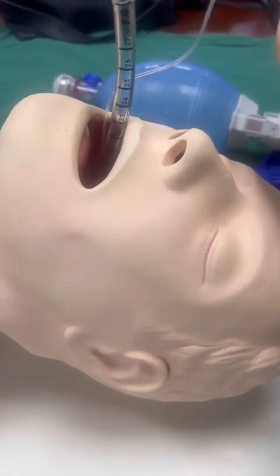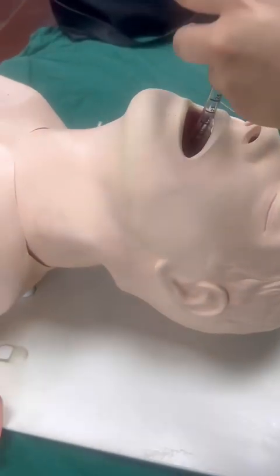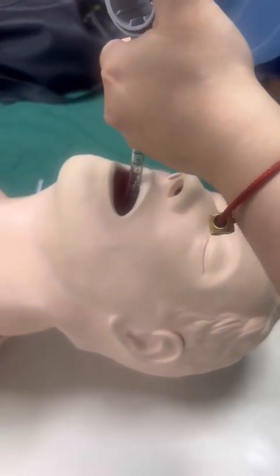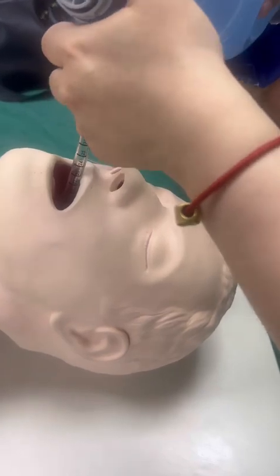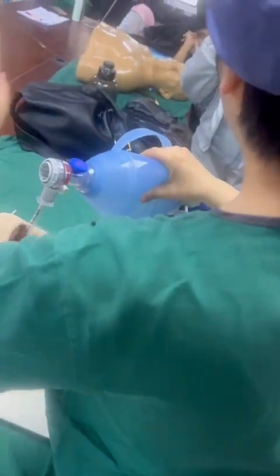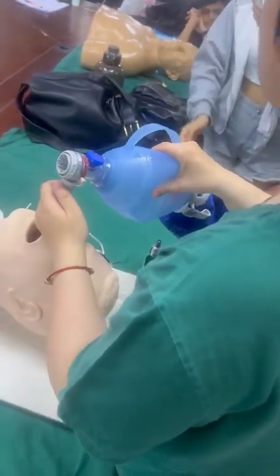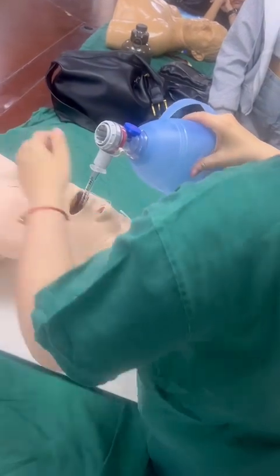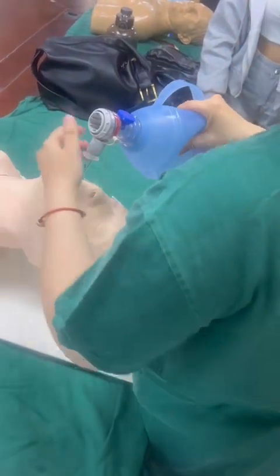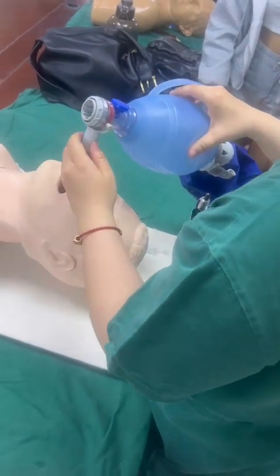Give the cuff inflation. Connect with the machine, also can connect with the respirator. First we need to check chest rising and listen to the five points, the sound of the lung, and check the position is right.